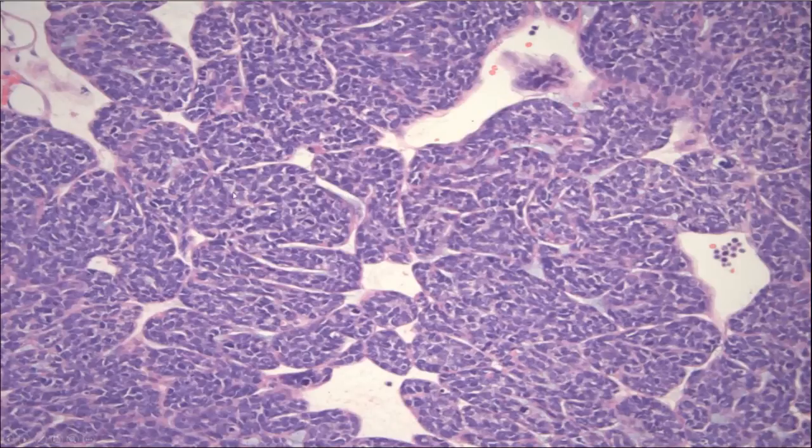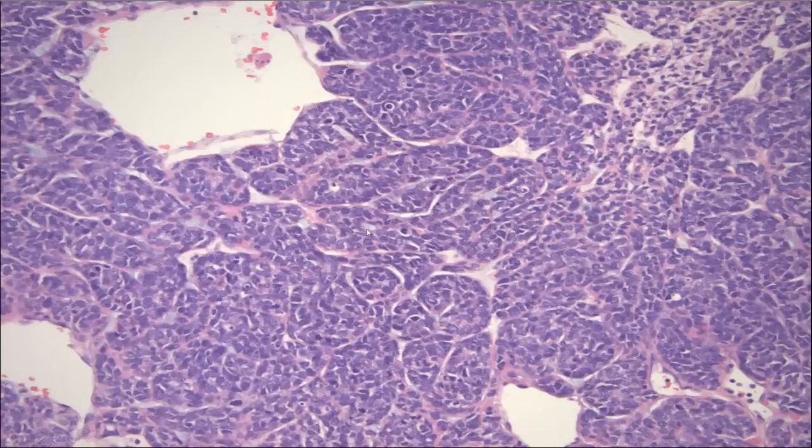And then we undergo just a little bit higher power. Again, we see this nested appearance, very vascular neoplasm. And so we begin to build a differential diagnosis. We look in these areas here, nests, we have sort of myxoid stroma, and we begin to build more on what could give us a nested appearance, very vascular, myxoid stroma.